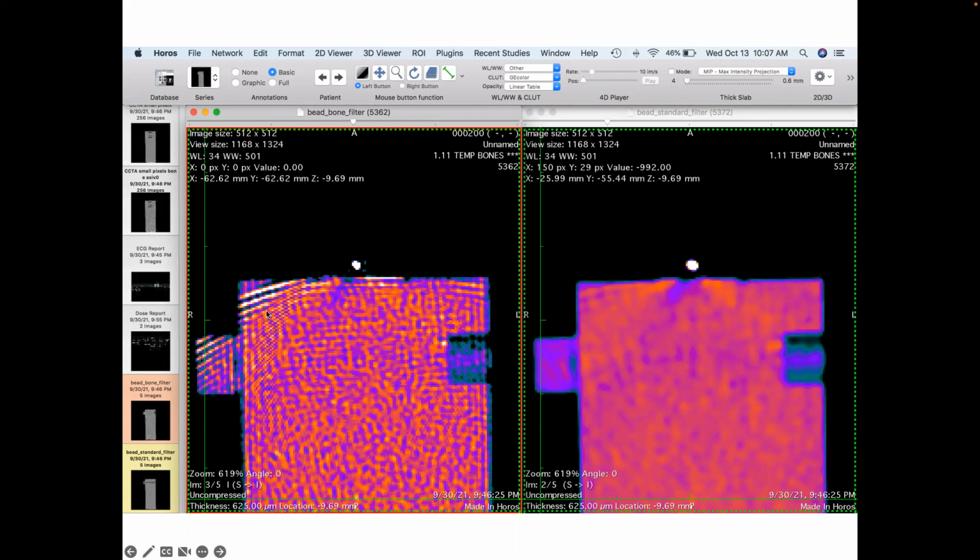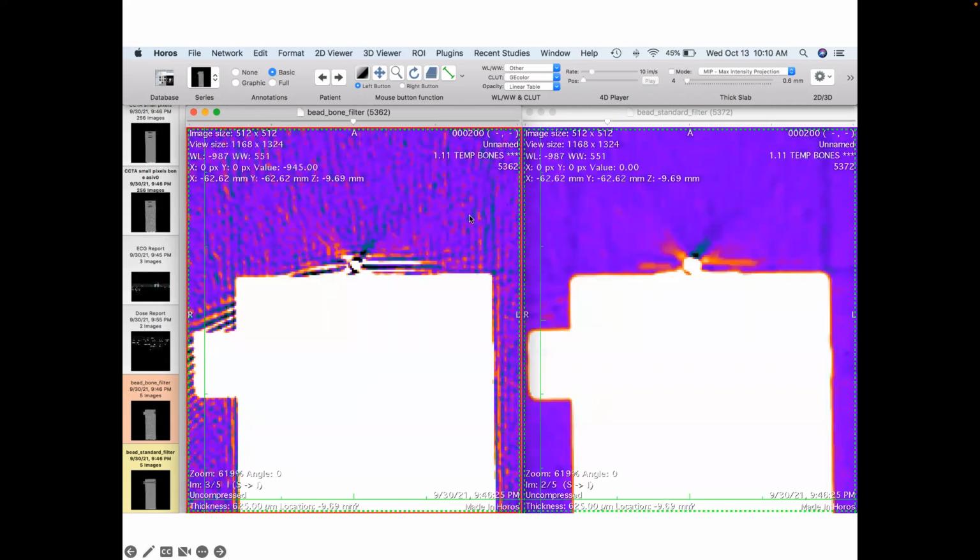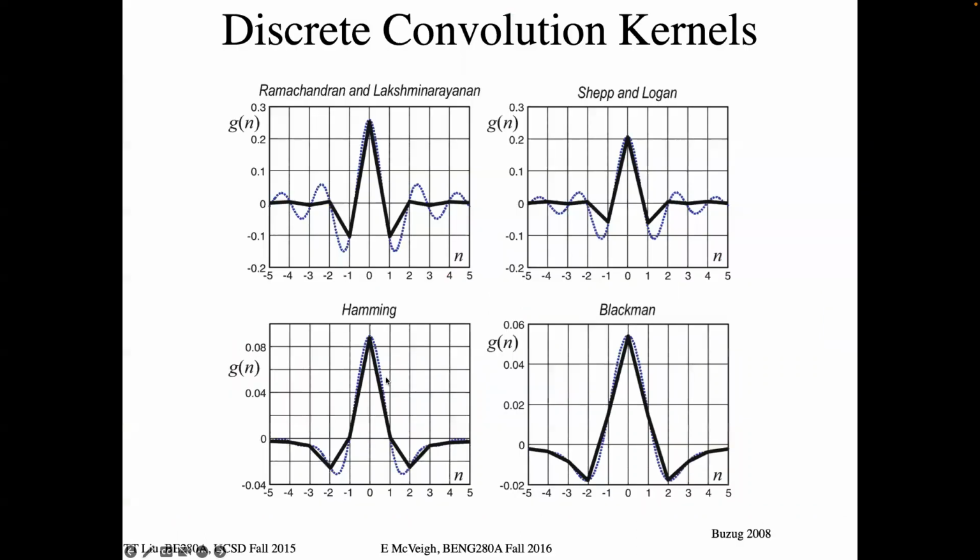And also, as you alluded to, things didn't go well at these edges. They just didn't fit right. You know, they're sort of halfway between pixels or something, and it generates these enormous ringing artifacts, right, off those edges. And that's from the abrupt truncation of the data. Okay, and then this is what the background looks like. So you have background noise here, higher background noise, and more ringing out into the periphery.